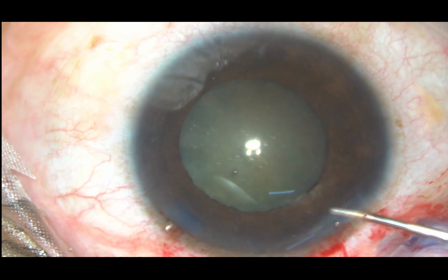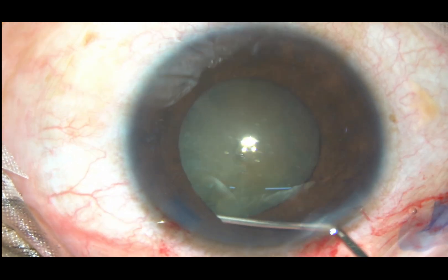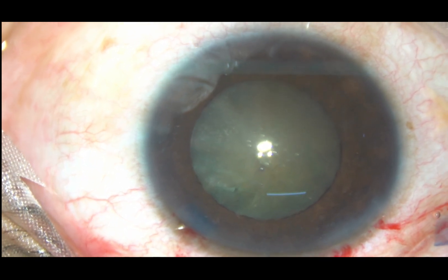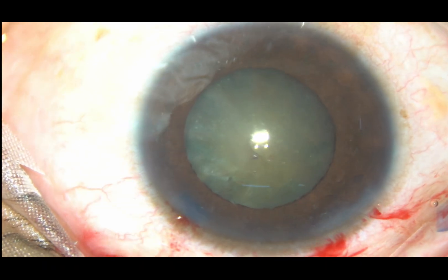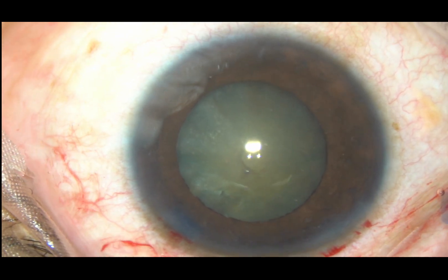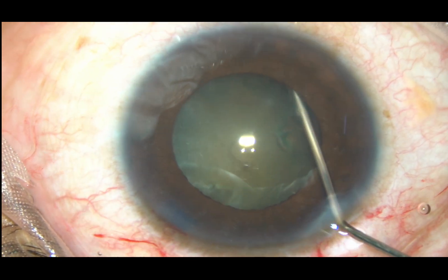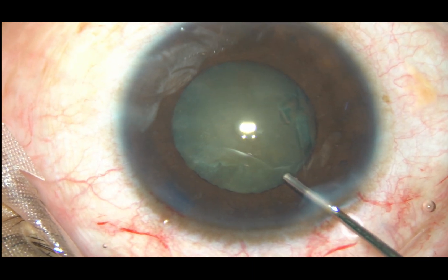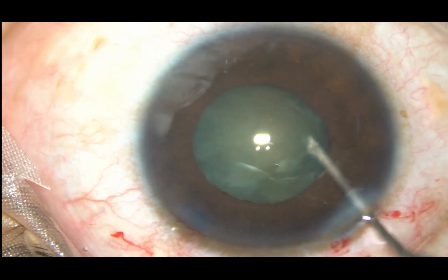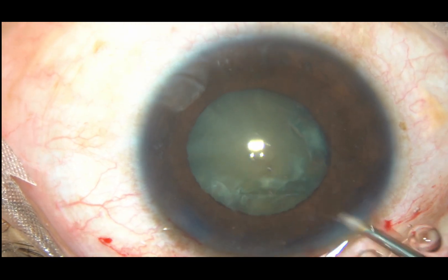Now hydrodissection is being done. Fluid wave is passed just underneath the anterior capsular rim — must be very gentle. As the cataractous lens lifts off, we must not inject any more. We just tap the nucleus and we can do some more hydrodissection at another place. Now the nucleus is mobilized and we find that the nucleus is rotating nicely.